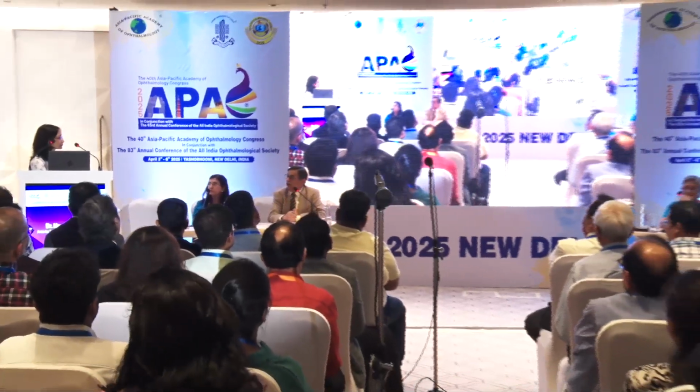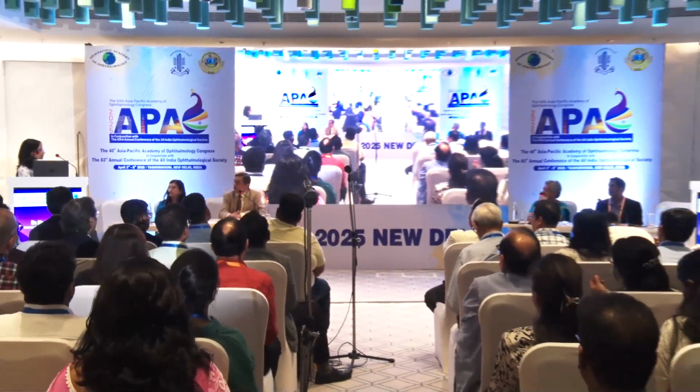Thank you, Dr. Hemlata. Any questions from the audience for Dr. Hemlata or from any of the panelists? So Hemlata, in your clinical practice, is there any particular situation where, as a routine, you plan that you have to do an anterior segment OCT before you go ahead?